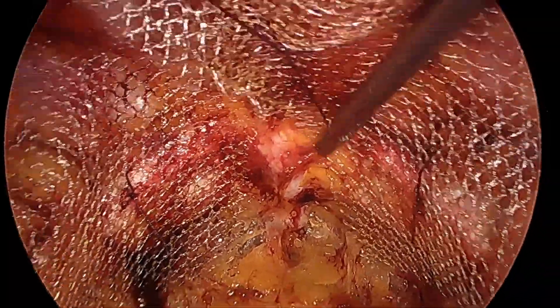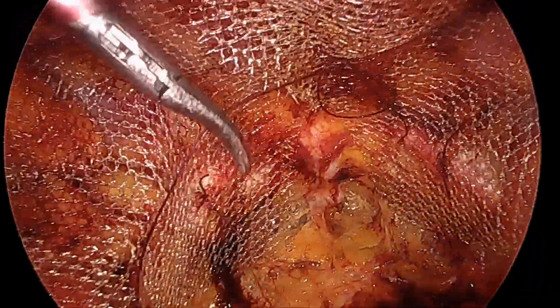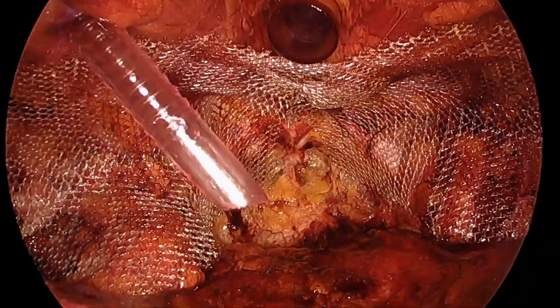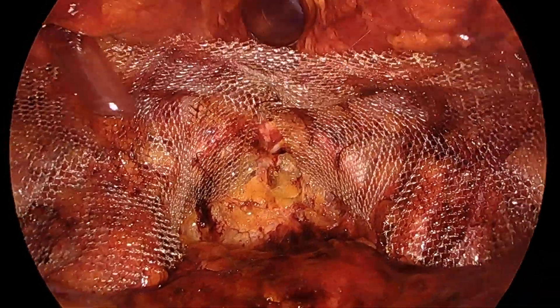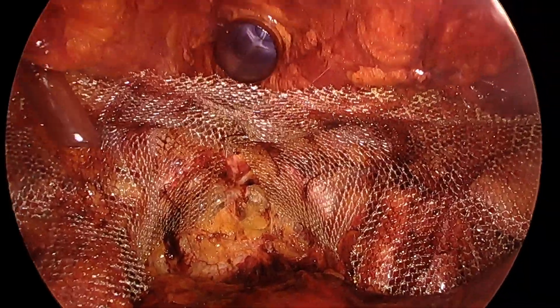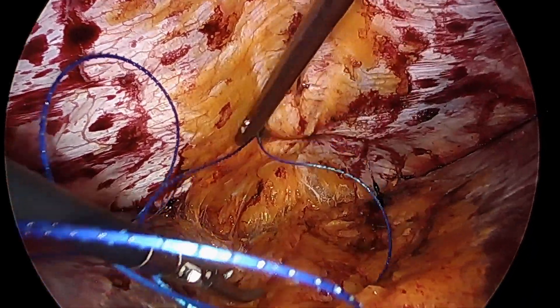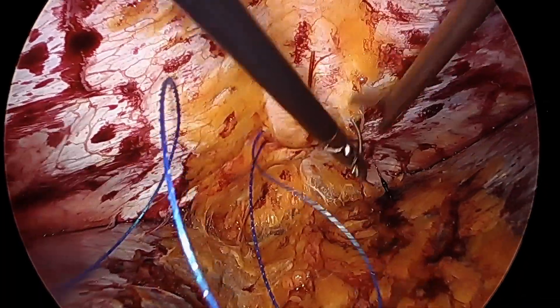By placing these very loose Vicryl stitches, I am almost certain that the mesh is not going to shift or change when we are doing the rest of the surgery for the ventral hernia. So back in between the patient's legs, we're now looking towards the patient's head.